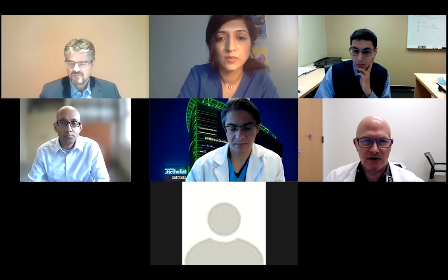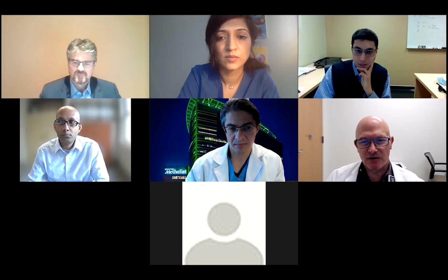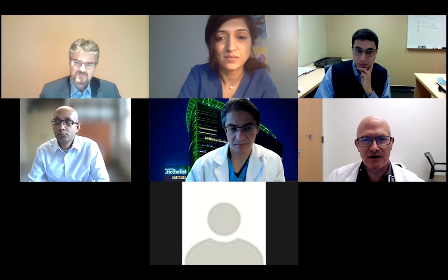Another group of patients that I have trouble with in our lab is AFib with rapid ventricular response, right? They're a group that we tend to avoid. I don't know about others on the webinar.